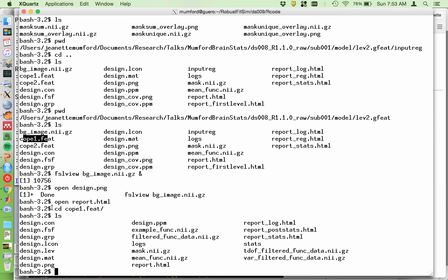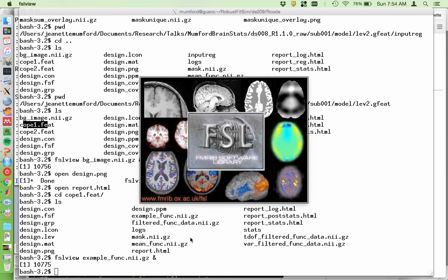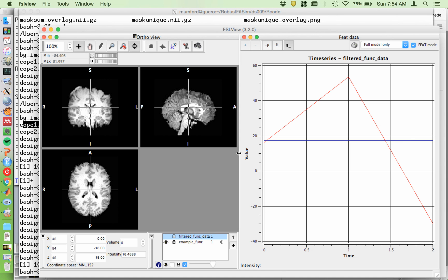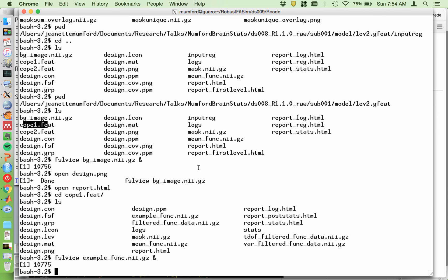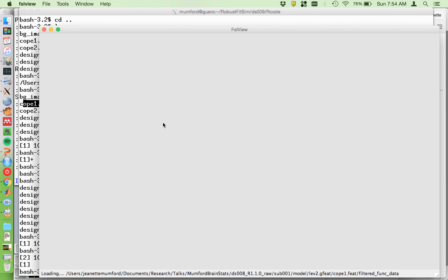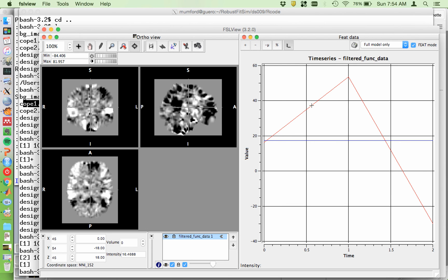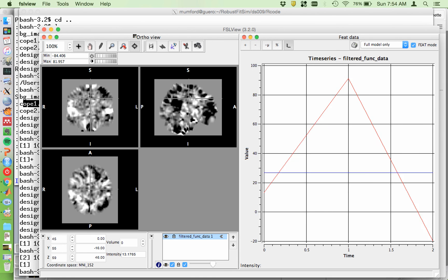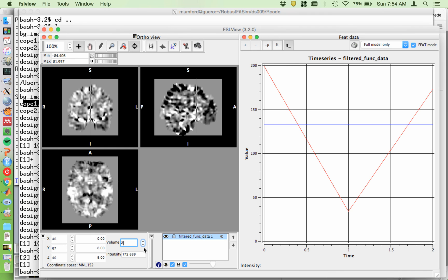Let's go into one of these. This just has copies of all the design setup stuff and the example func image, which is just the mean func. Let's look at it — at this level it's just the structural. Then we have the filtered func data. That is actually a good way to check over your data, both here at the second level and at higher levels like the third level. This is just showing you the time series plot of the data, and you can flip through — there are only three here — but this is the dependent variable, and you want to make sure it looks pretty good.